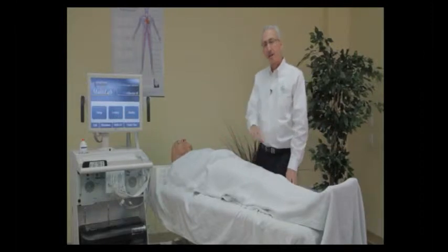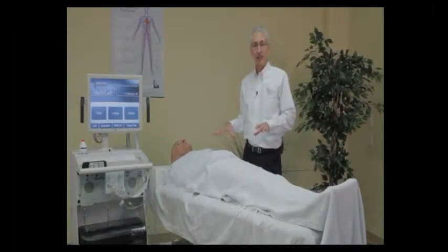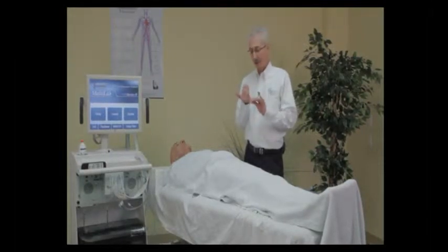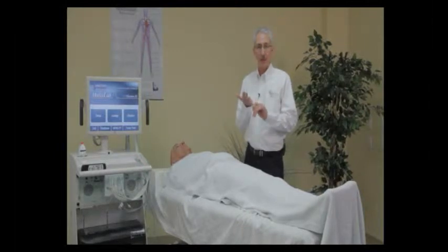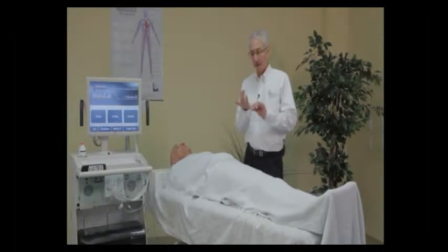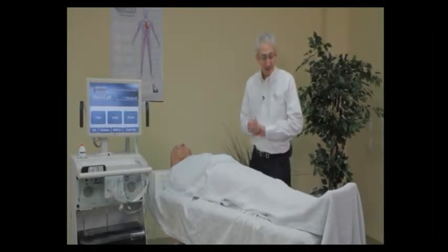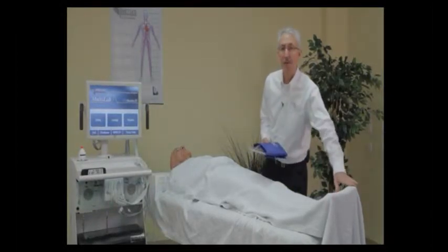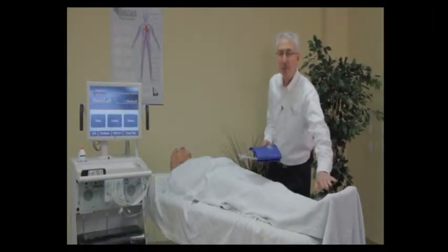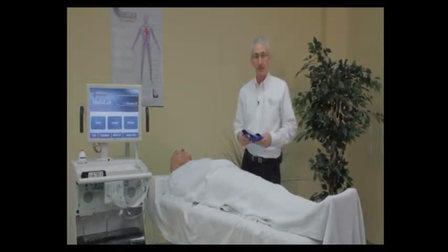My patient is covered up. The exam room is on the cold side, and we're going to be measuring the patient's extremities. If we leave him uncovered for too long, he's going to vasoconstrict, which is going to skew our results. When doing work on the toes — taking toe waveforms or toe pressures — any cold exposed toes are going to give you an erroneous reading. So check your exam room temperature before you begin.